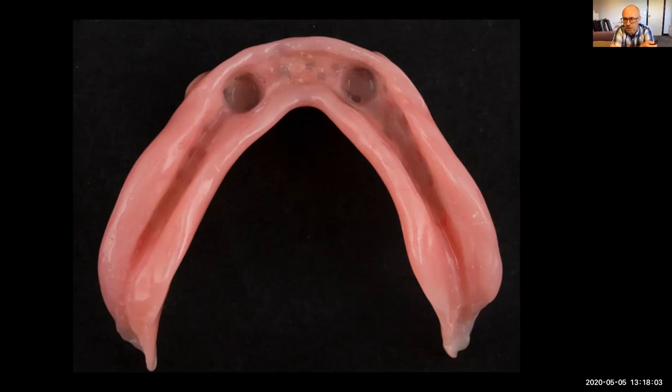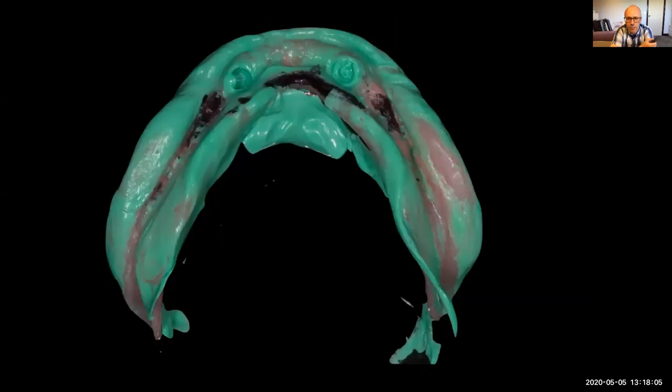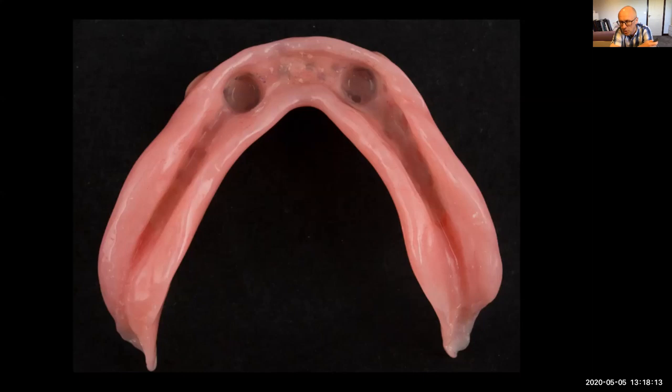So we'll have Lynn in the chair. I put silicone on the fitting surface of the denture. I'll just go back, if you imagine that. So I'll try this in first like that and press it down hard. I'll ask Lynn to identify with it when it's in the mouth where it's sore, and she'll say, "Oh, a bit on that inside bit."